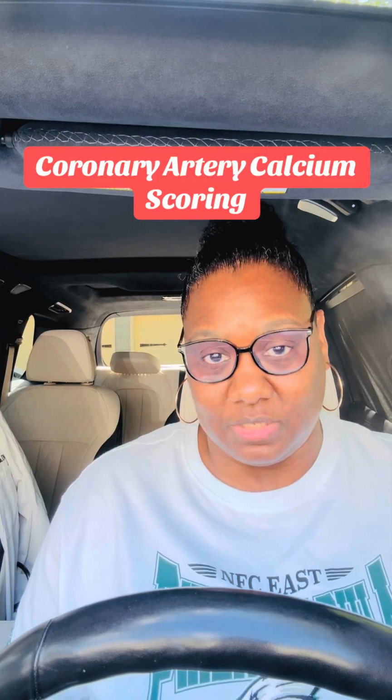Medication number 2, sublingual nitroglycerin. Just as you want the heart rate to be nice and steady and on the lower side, you also want the blood vessels of the heart to be as open as possible so that, again, you get good, clear pictures.